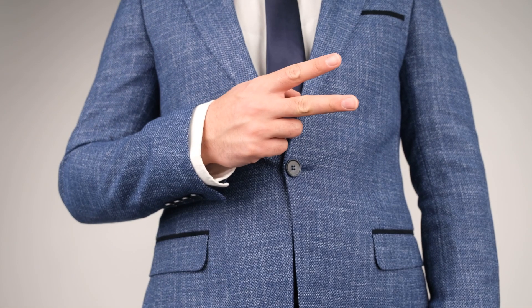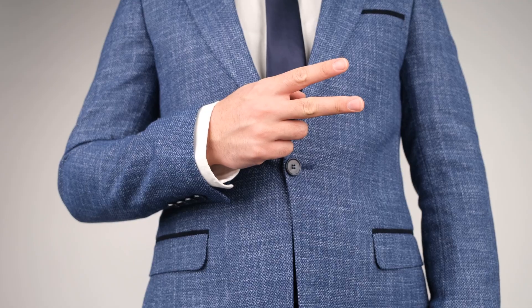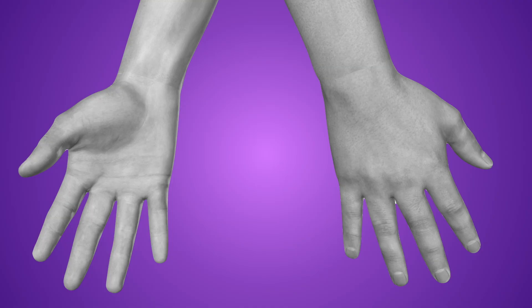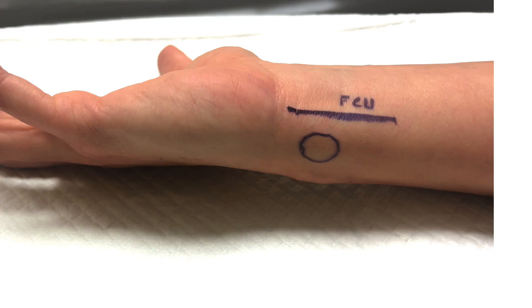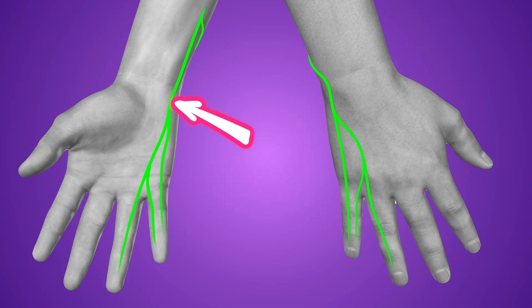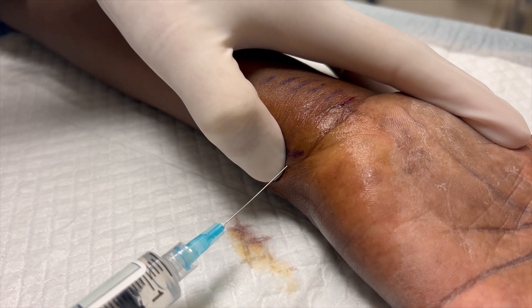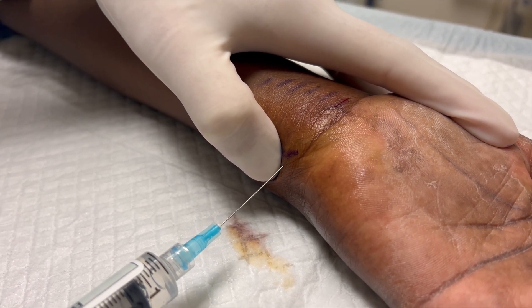There are two more nerves that need mention because these can frequently be the source of an incomplete block. First, the ulnar nerve gives off a dorsal cutaneous branch five or six centimeters above the ulnar styloid, and it runs in the subcutaneous tissue between the ulnar styloid and the FCU tendon. It's responsible for the dorsum of the medial hand and is occasionally missed when doing a pure ulnar nerve block. For that reason, when I'm doing an ulnar nerve block, I always save one to one and a half mils to inject subcutaneously on the way out.